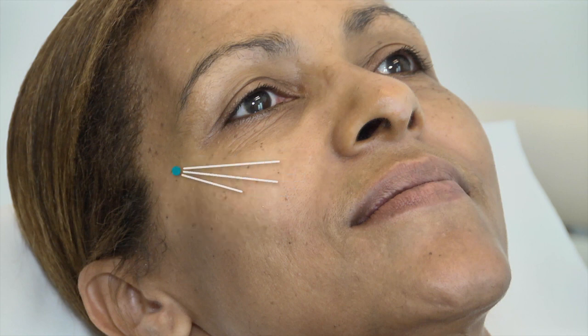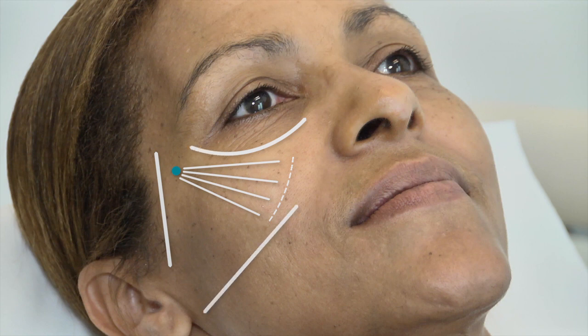Injections are done in the malar area using a fanning technique, horizontally toward the mid-jugal and respecting the lower limit of the eye ring, expanding downward to an imaginary line linking the alar triangle to the tragus.